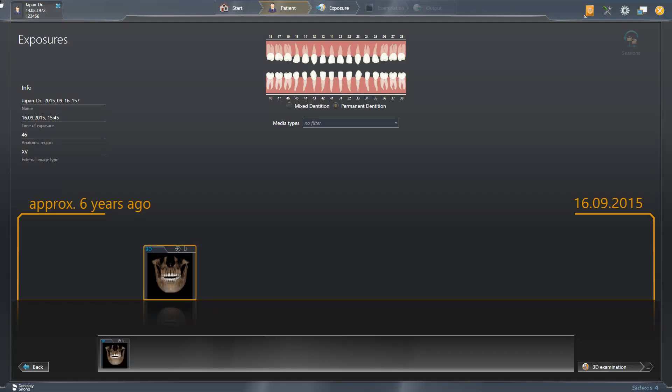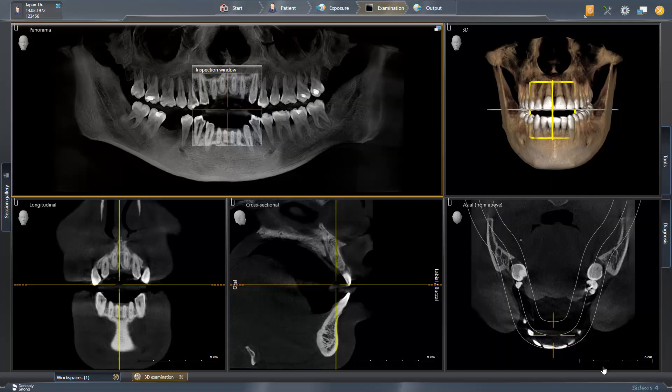Next, you can load the data set directly for a 3D examination. Now the X-ray data is opened and we switch directly to the final step, Output.